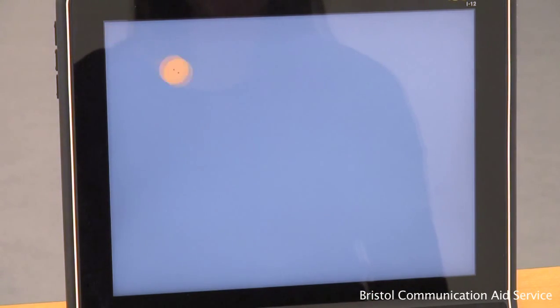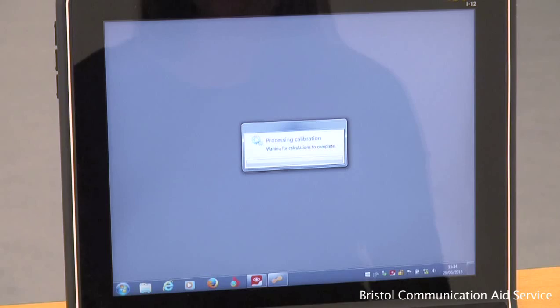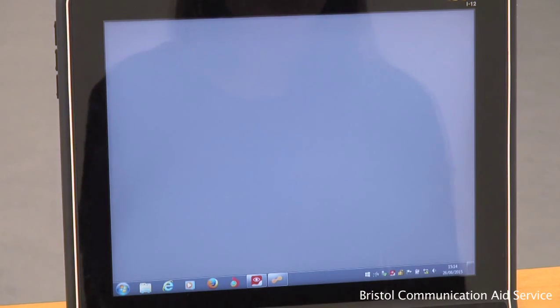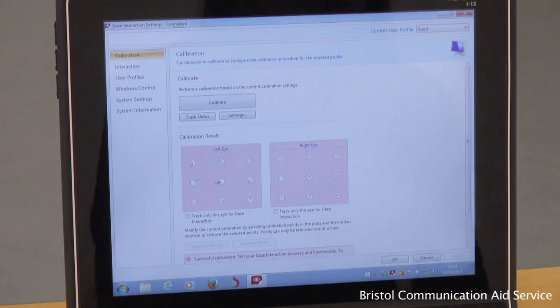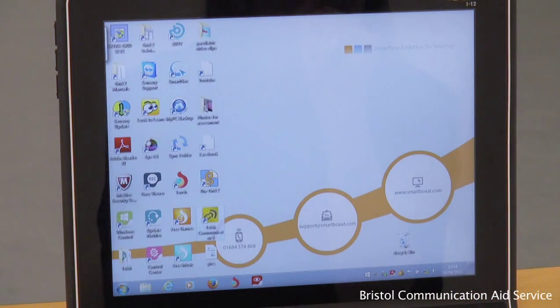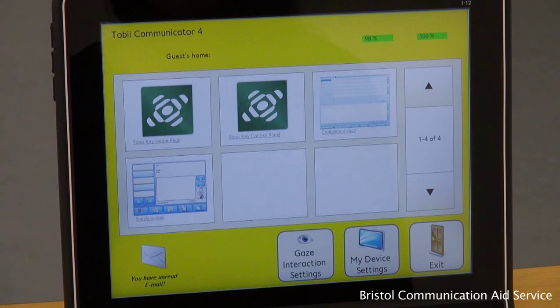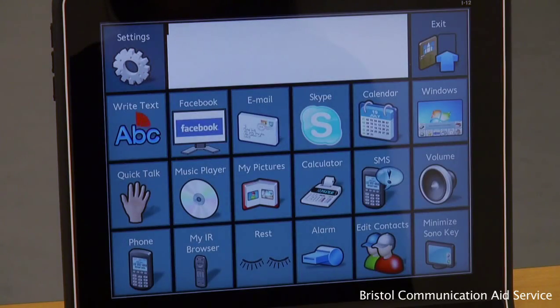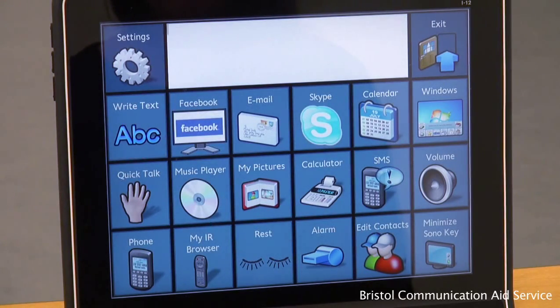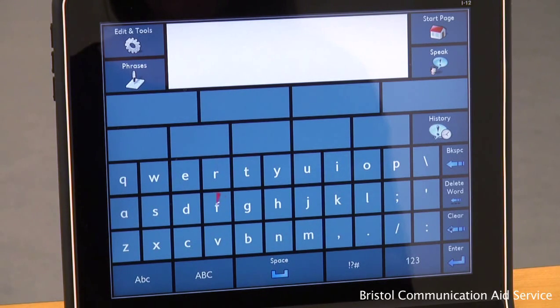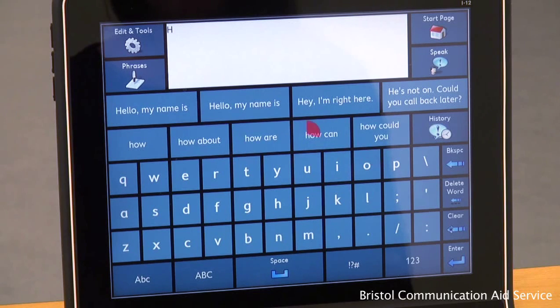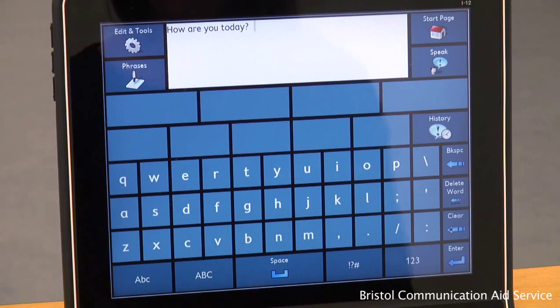Only the target points will appear for calibration. Once calibration is complete, you can then open your communication software package of choice and select your preferred communication program. Communication is made possible as the user allows their eyes to rest on the option they wish to select, waiting for the dwell to finish. Use of word prediction cells can allow for faster construction, and once the message is complete, the user can select speak. How are you today?